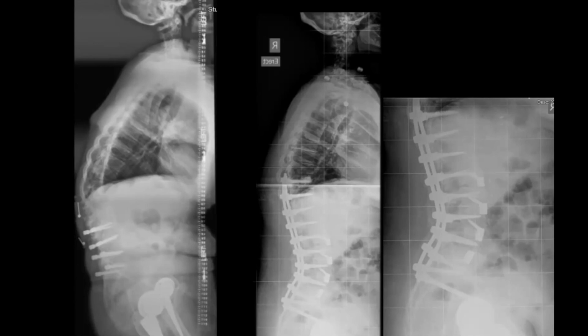Yeah, that's a very good point, Christoph. Thanks for bringing that up. And one of the things about sizing the grafts that I really tend to do pretty aggressively is especially when I'm trying to put in grafts that are more lordotic, so a 24 degree graft, for example. Especially when I go for my more hyperlordotic grafts, first of all, I make an effort to get my posterior height. And typically, I like to have at least 7 millimeters or 8 millimeters of posterior height. And for exactly that reason that you indicated, Christoph, I don't want to create foraminal stenosis.